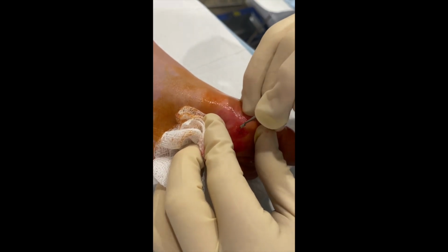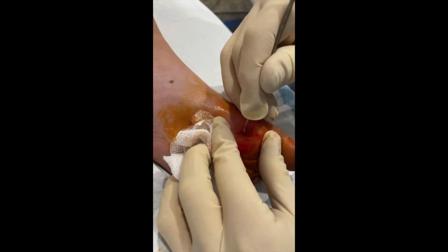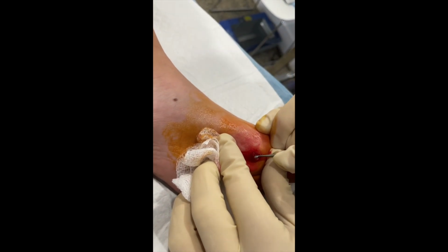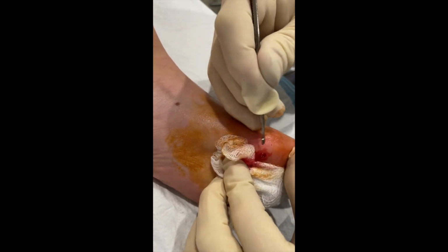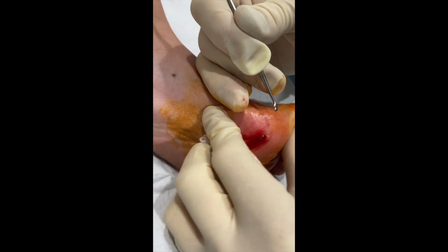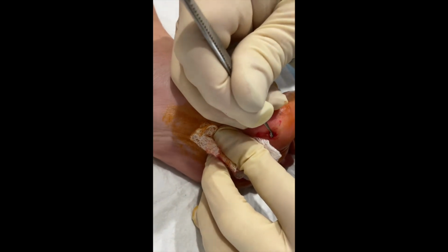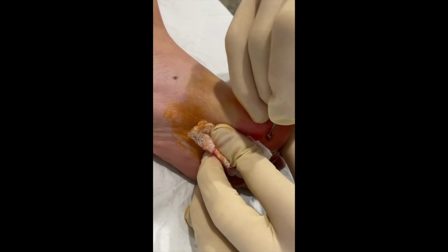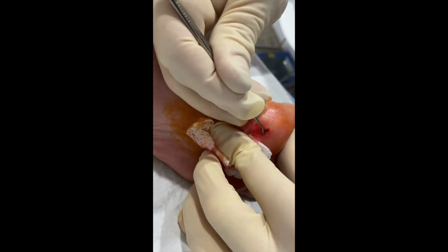So now that it's been needled, I then move to a curette and start to remove the actual infected tissue. It tends to come out in a bit of a lump when you do it. The infected tissue all sticks together, so it's actually quite easy to get out. One thing that you've got to make sure with this though is that you do get all of the remnants of the plantar wart and virus out, otherwise it can come back again.